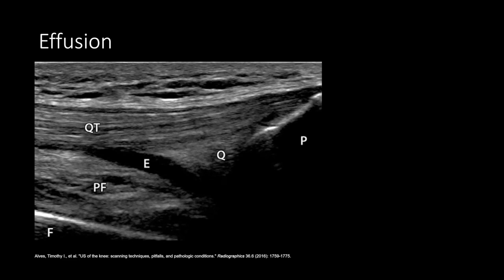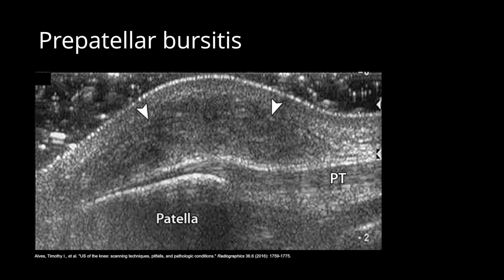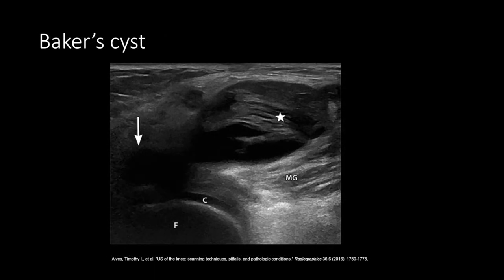Here is a small, simple joint effusion denoted by E at the suprapatellar recess between the suprapatellar fat pad and the prefemoral fat pad. Here is some complex fluid at the prepatellar bursa. This is a complex Baker's cyst denoted by the star. Make sure to show the neck between the Baker's cyst and the joint. The arrow is pointing at anisotropy of the semimembranosus tendon.